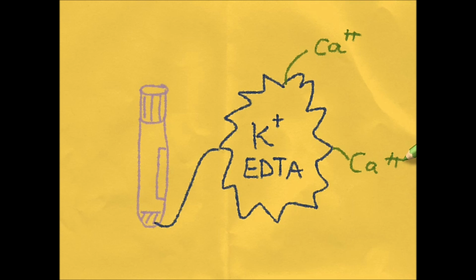However, it's very important to ensure that the right blood to EDTA ratio is present. If there's too much blood, the sample may clot, but if there's too little blood, and so a higher proportion of EDTA, this may affect the way the cells appear when they're examined under a microscope. The bottles are vacuum sealed to allow the right amount of blood into them, but there's also a mark on the side of the bottle.